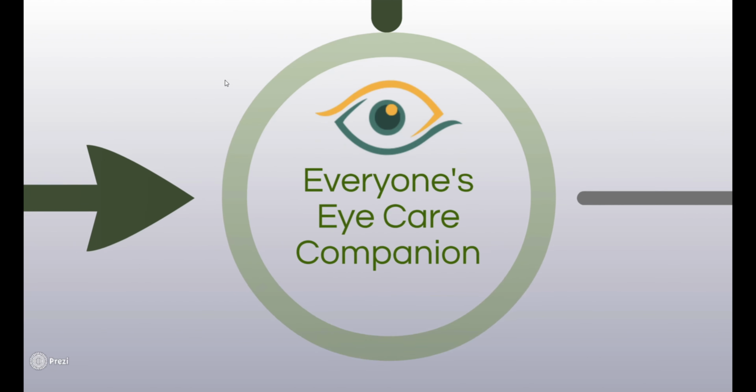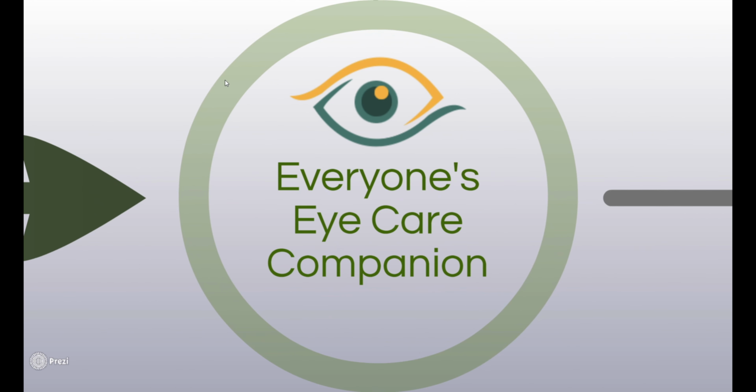EyeSee will be a revolutionary new tool in the arsenal of optometric and ophthalmological technology. EyeSee will serve as a one-stop solution to all fundamental eye care for every individual with a smartphone and internet access.